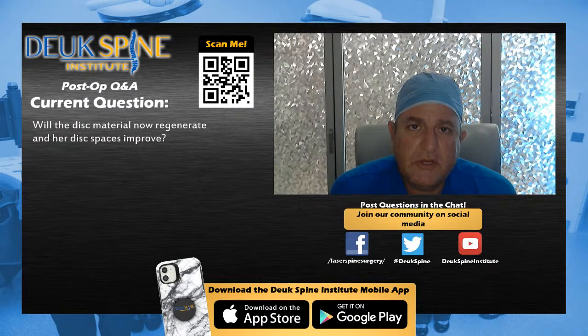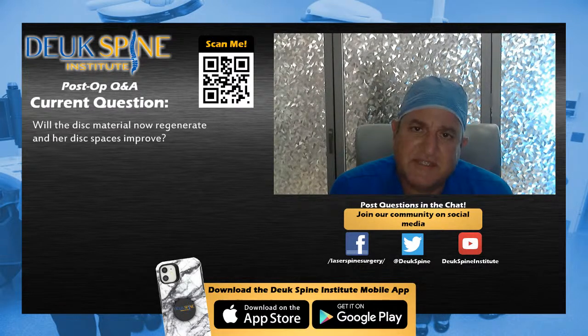So we had some good questions today about what to do about bone spurs, and can the laser take care of bone spurs? Yes, the laser can definitely fix any bone spur that needs to be fixed. The laser can melt metal, and melting a bone spur down is easy. The problem with getting the bone spurs is that they bleed. Once you start getting into a bone spur, those bone spurs have a blood supply. So once you start shaving it down, it starts to bleed a little bit. And that's kind of what we saw a little bit of today, early on in the case, a little bleeding.